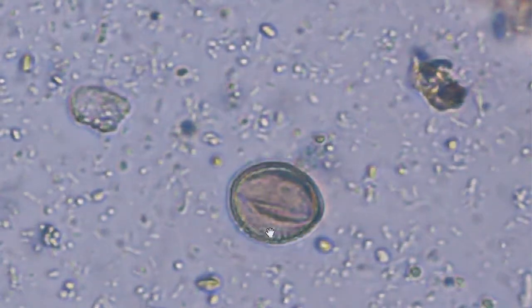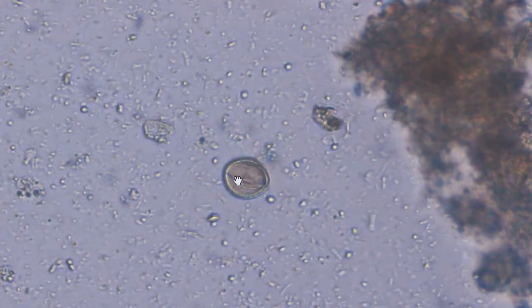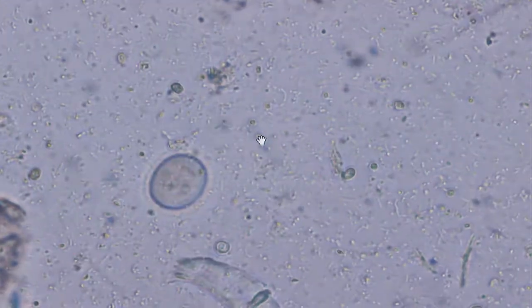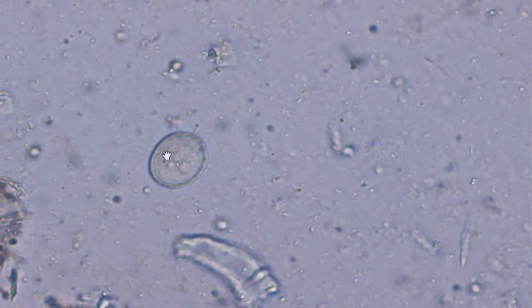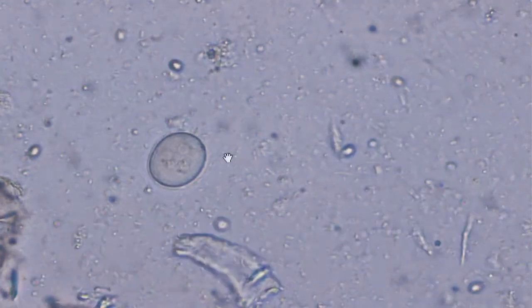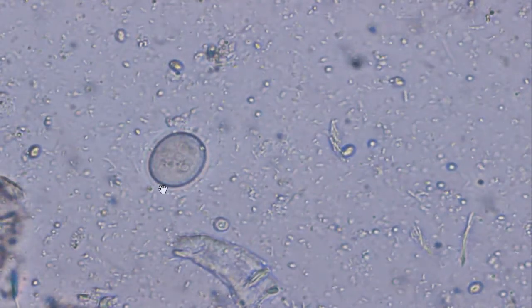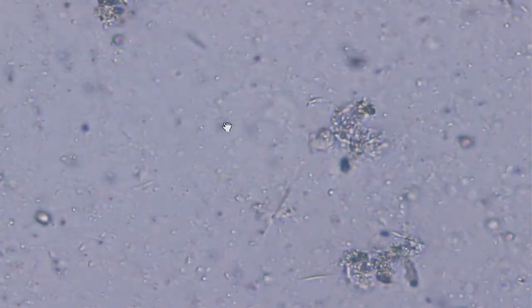Here, you might see these quite a lot in your wet preps. This is a pollen grain. However, to one side of this, we have another cyst of Entamoeba coli. 1, 2, 3, 4, 5, 6, at least 6. There should be about 8 nuclei if I looked carefully. You'll notice this isn't perfectly round. This is slightly oval. That's not unusual for cysts of Entamoeba.